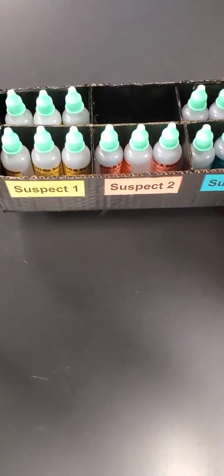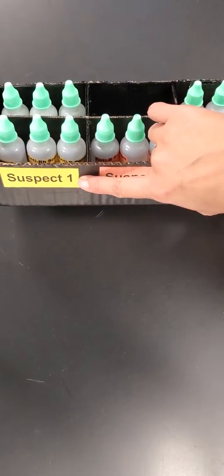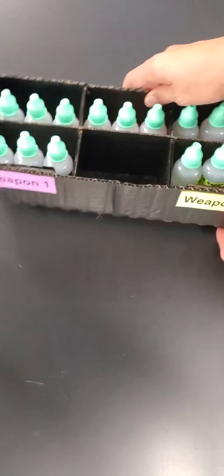Okay, students, so the materials that we're going to be using today are as follows. If you notice, I have a box here with all the anti-serums, and they're labeled based on all the testing that we're going to do. We're going to test all three suspects, and then we're also going to test both weapons.